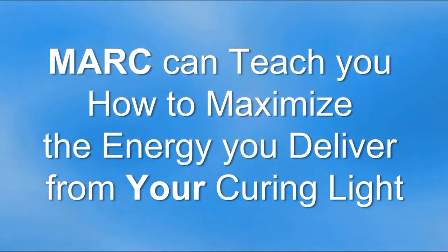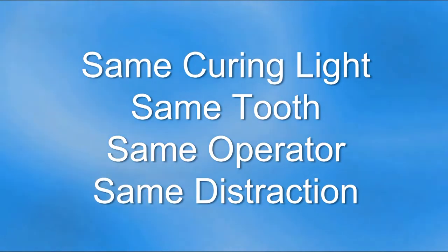Mark can teach you how to maximize the energy you deliver from your curing light. In the next clip, we're going to use the same curing light on the same tooth with the same operator and the same distraction, to see what happens when the operator is paying attention.